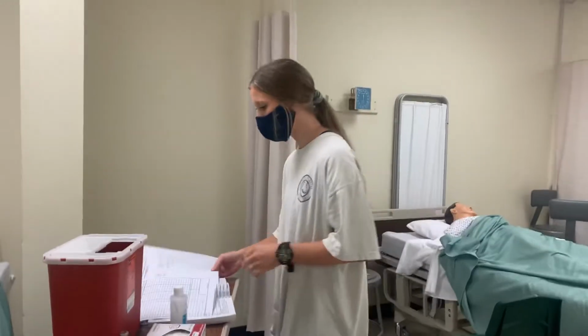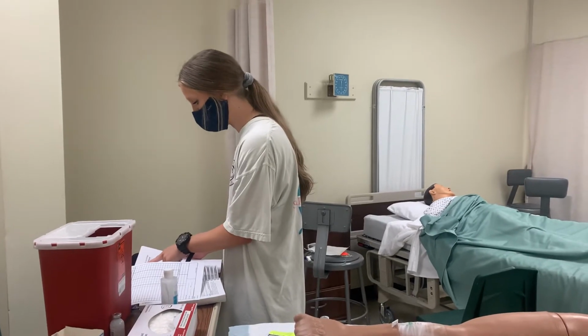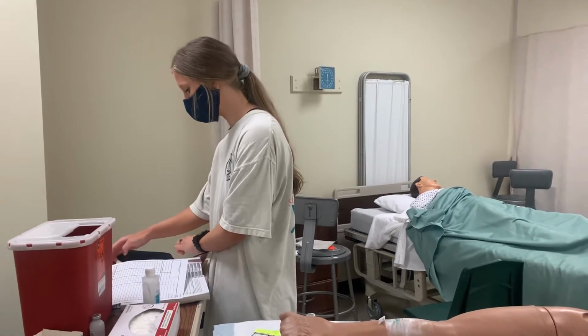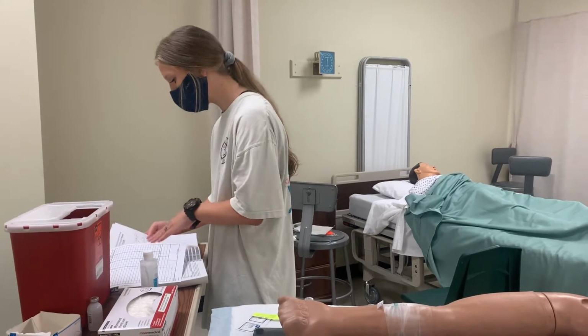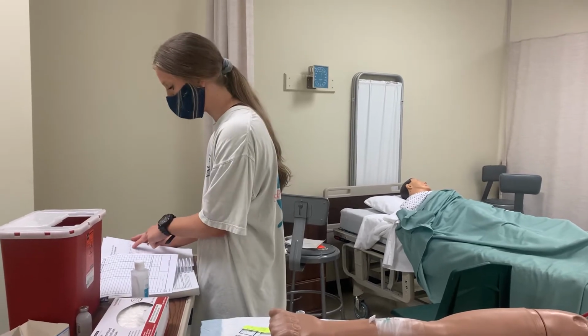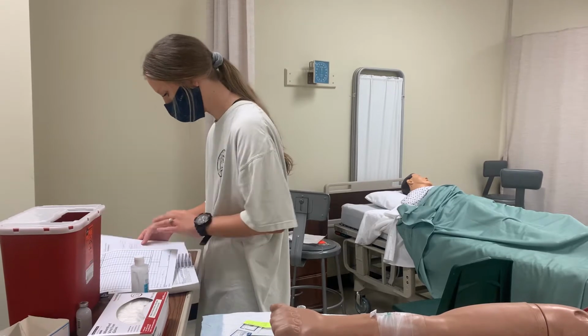Alright, I have an order to give furosemide 20 milligrams IV push every 8 hours, and I've used this label below to calculate the rate and volume of administration. I'm given 20 milligrams, and my vial contains 100 milligrams per 10 milliliters. After I did my math problem, I'm given 2 milliliters over 1 minute.